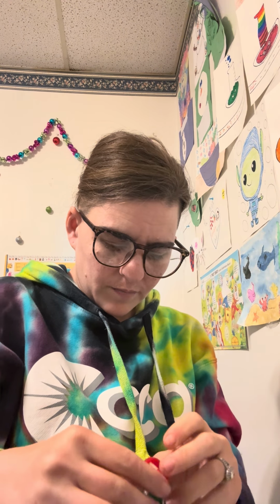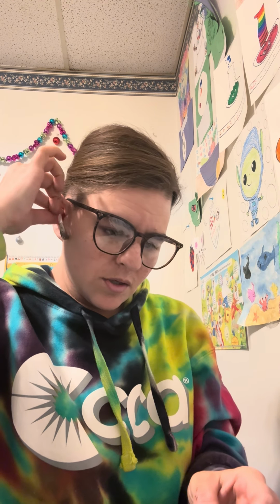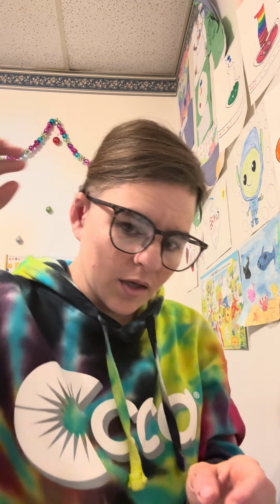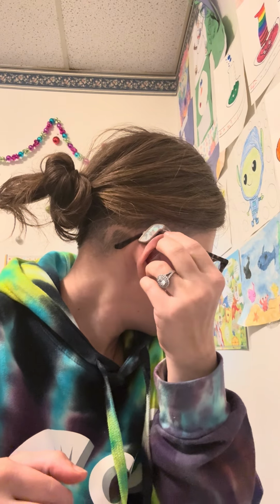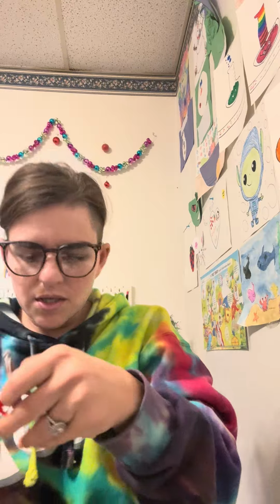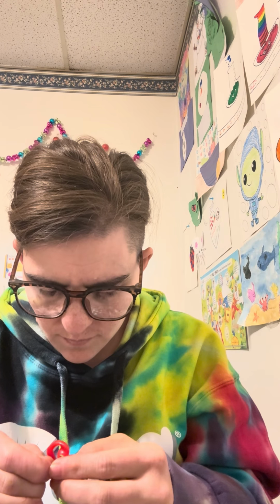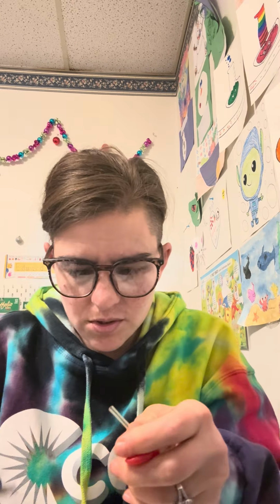Anyway, so then you put it on your ear, put the ear mold in first. Now mine's not on, so it still shouldn't be on. So don't worry about the ear plugging. And you see, turn your head. You see how much gap you have? You need to cut it. So then you just keep cutting it down to where you need it. Okay. And then you just cut it a little bit more with your scissors.